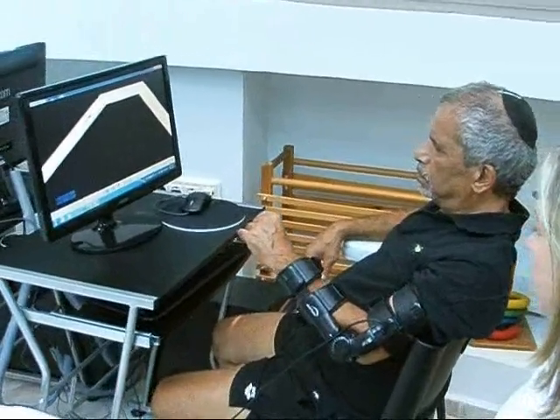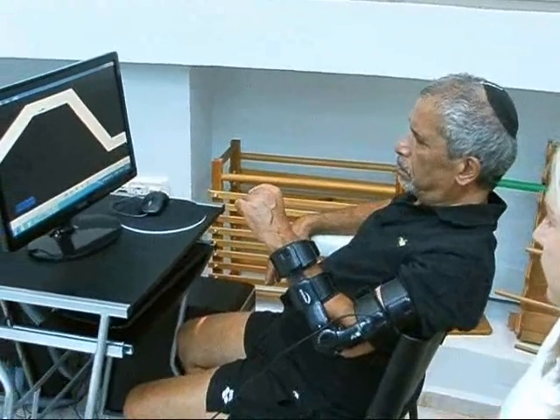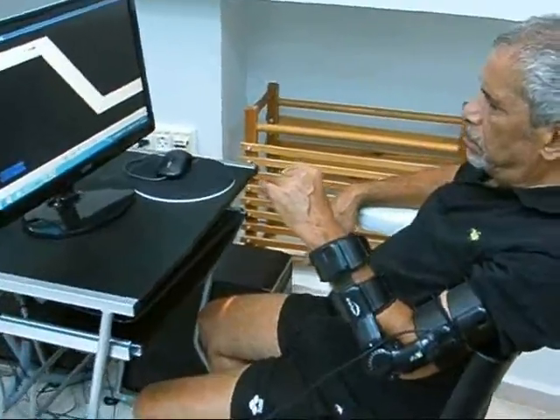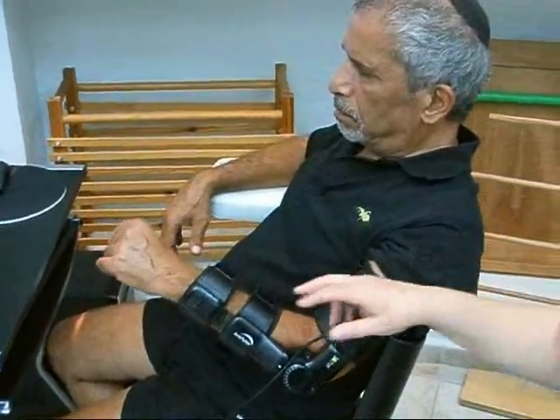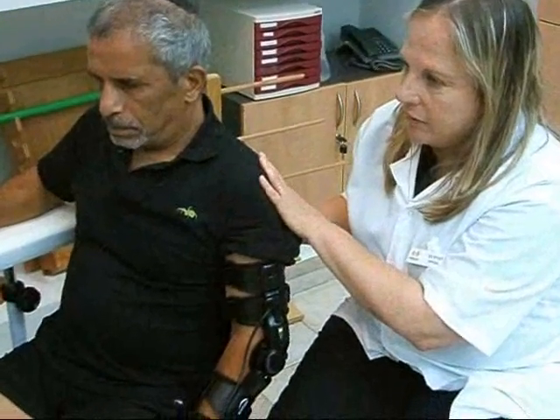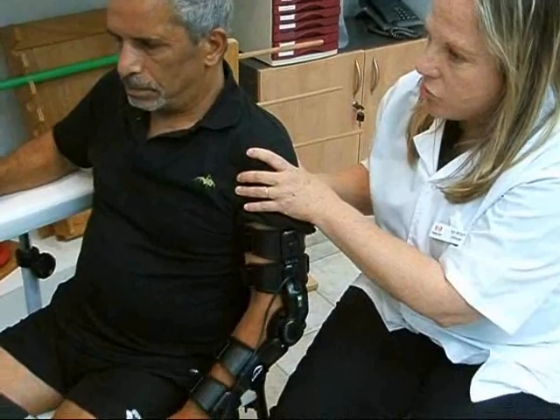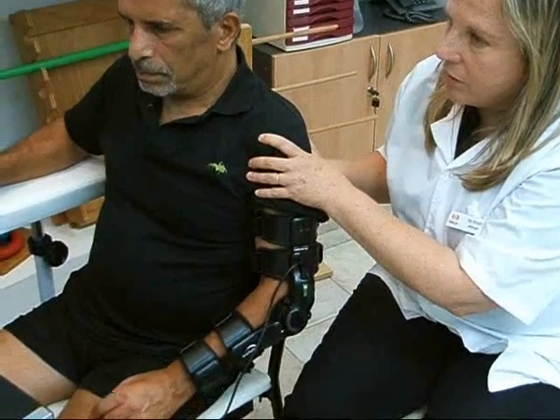Here you see the patient performing intensive active elbow flexion and extension exercises according to his movement ability. The system allows the patient to practice repetitive active exercises in the form of motivating and challenging games.